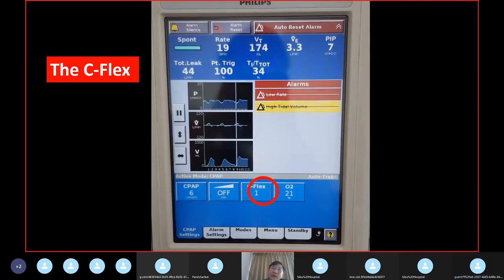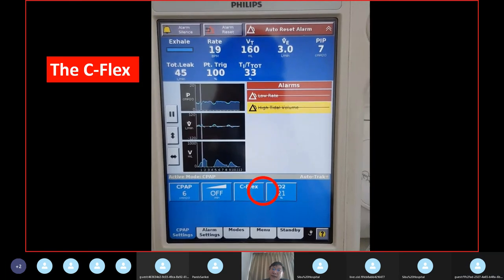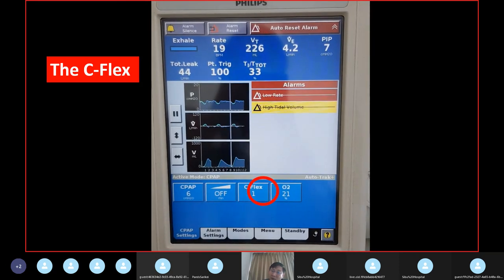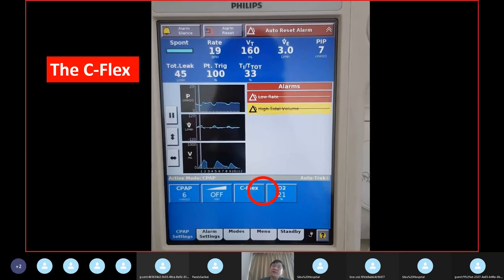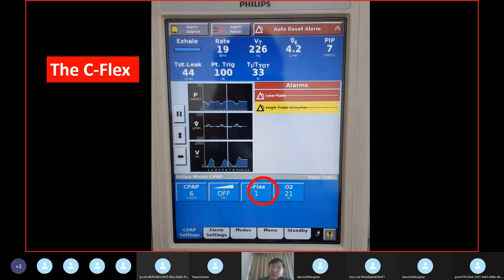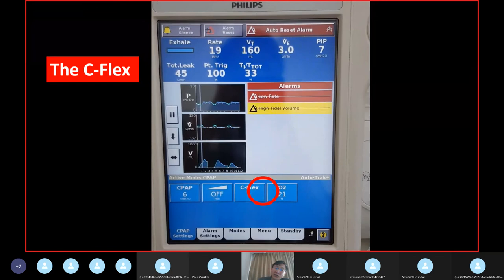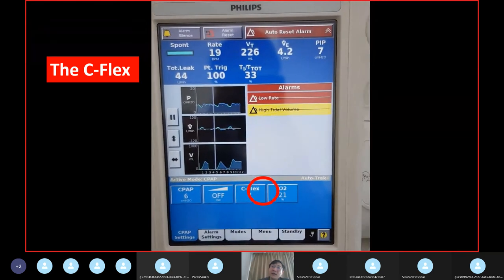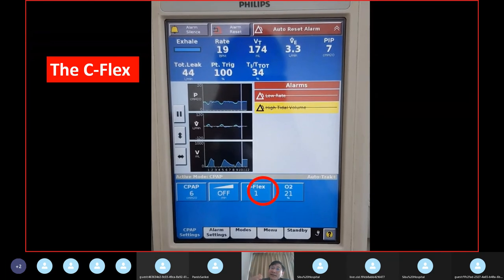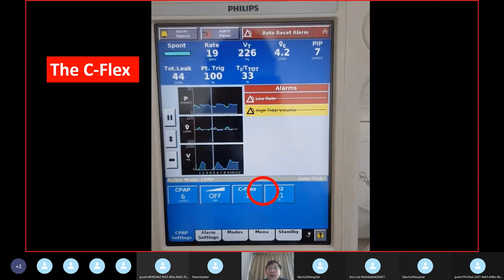So that means you start with a very low difference, the gap between the high pressure and low pressure. And only when the patient is comfortable, because even with a pressure difference of 1, the patient will sense it, as there's gas coming down during inspiration. You don't want the gas to suddenly gush in, then the patient will not be cooperative, right? So then you slowly titrate it up from 7/6 to 8/6, and subsequently 9/6, 10/6, and 12/6. This kind of titration.